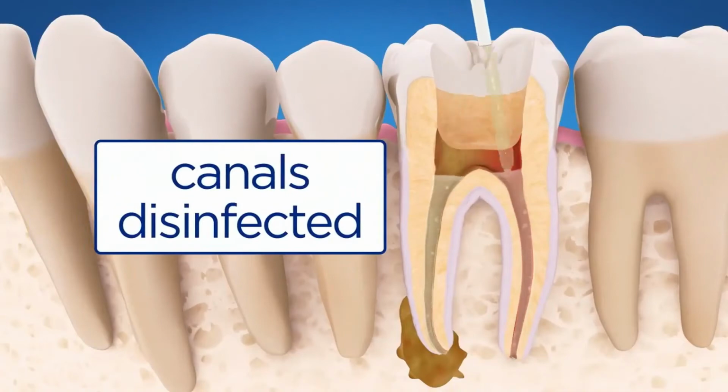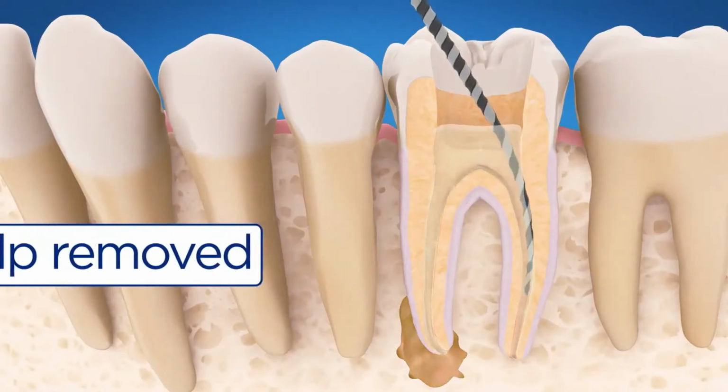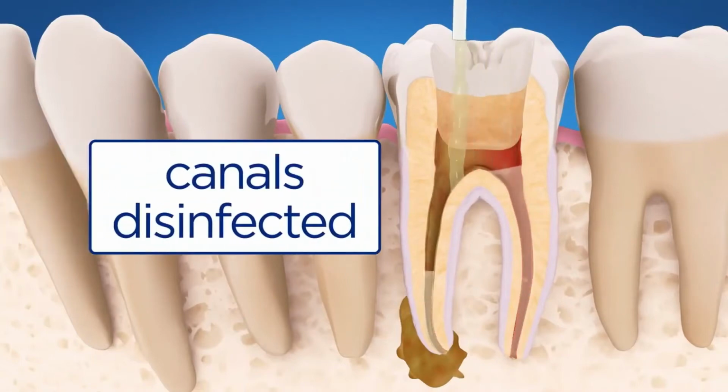Step 3. After we have cleaned the cavity, then it is time to clean the canals themselves. And that is actually the root canal treatment we are talking about. So in this step, we take small special instruments and we push them right through the canal up to where it ends, and then we use this to clean out all the infected nerves and blood vessels from the canal. After that, we use a disinfectant to disinfect the canals. That will ensure that all the infection is cleared from the canals.